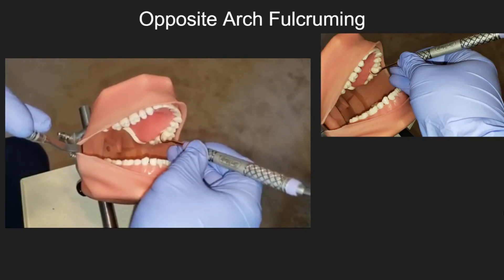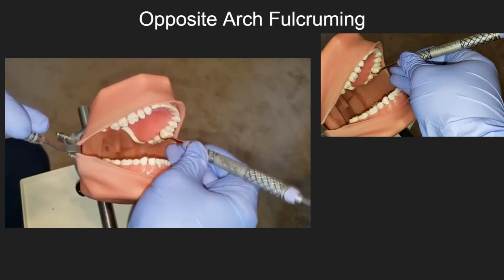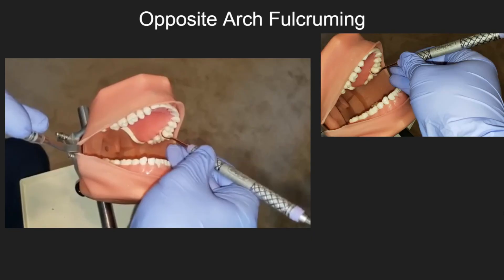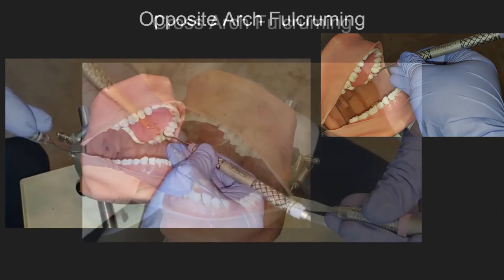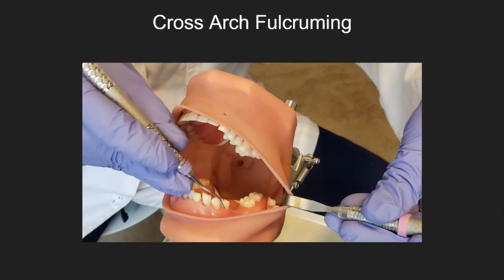Opposite arch fulcrum is achieved by placing the fulcrum on the opposite arch that is being instrumented. Cross arch fulcruming is achieved by placing the fulcrum on the same arch you are working on, but on the opposite quadrant that is being instrumented.